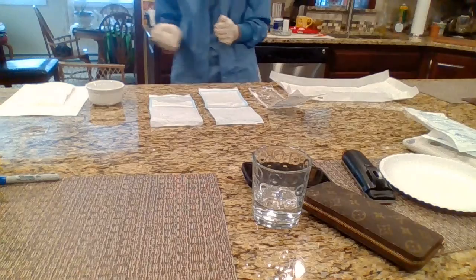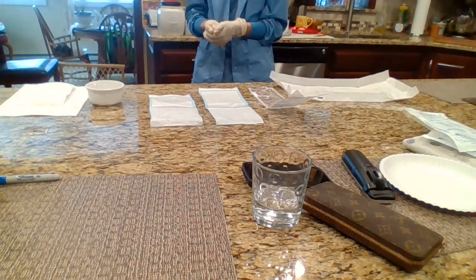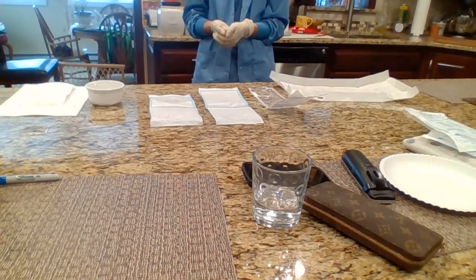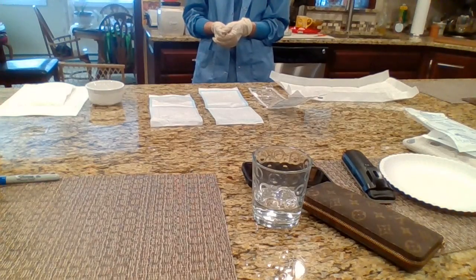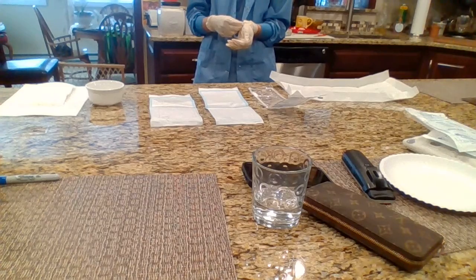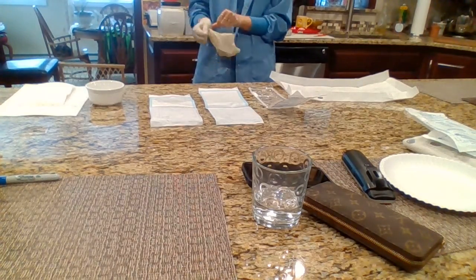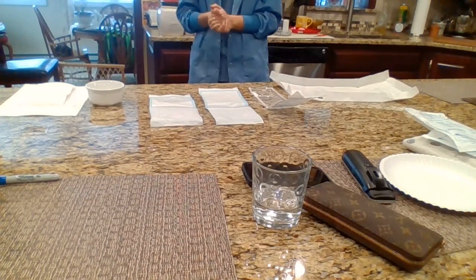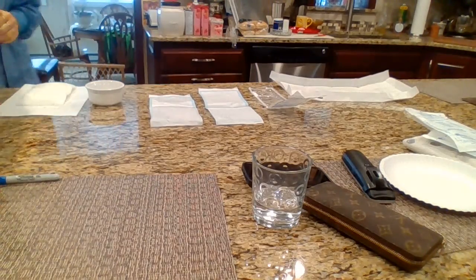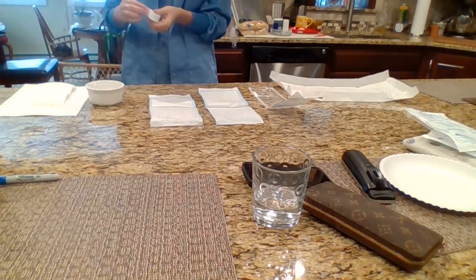So after that's all flattened out, I'm going to ask my patient, does he or she have any tape allergies, before I get ready to apply the tape. So if the patient says no, then you're all set to apply the tape, but before you would apply tape, you would want to always make sure to remove your sterile gloves. So after the sterile gloves are off, you're ready for the tape. The patient said they didn't have any tape allergies, so we're all set.